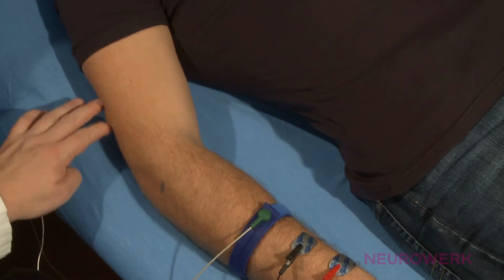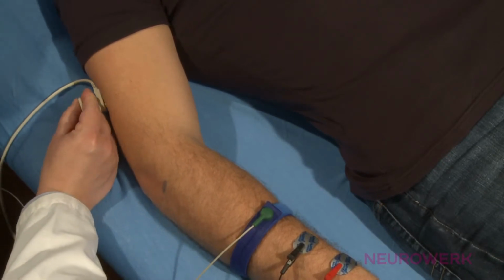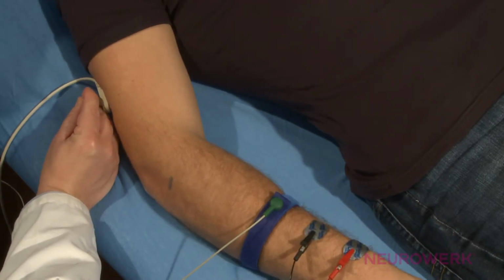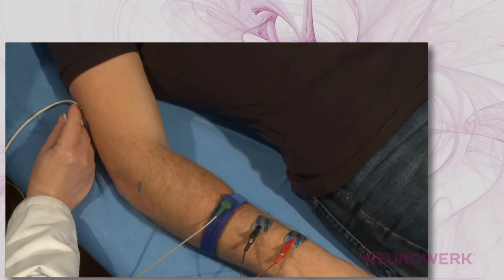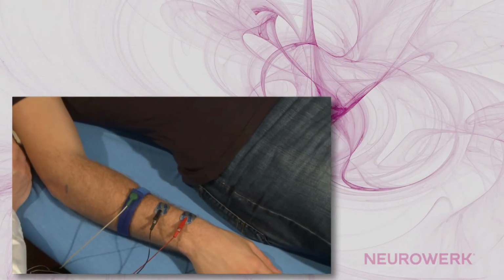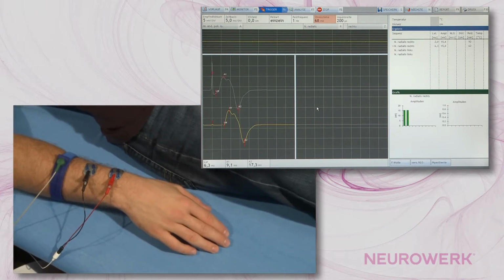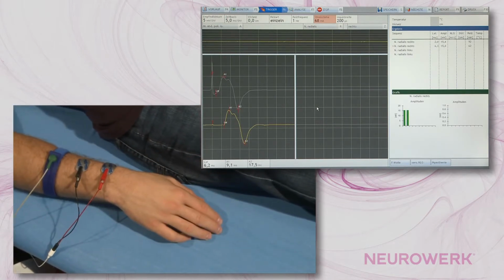The proximal stimulation of the radial nerve takes place at the lateral side of the middle of the upper arm. This stimulation should not cause any difficulties due to its easy-to-reach course of the nerve inside the radial sulcus. The radial nerve can be stimulated axillary in the posterior axillary fold.